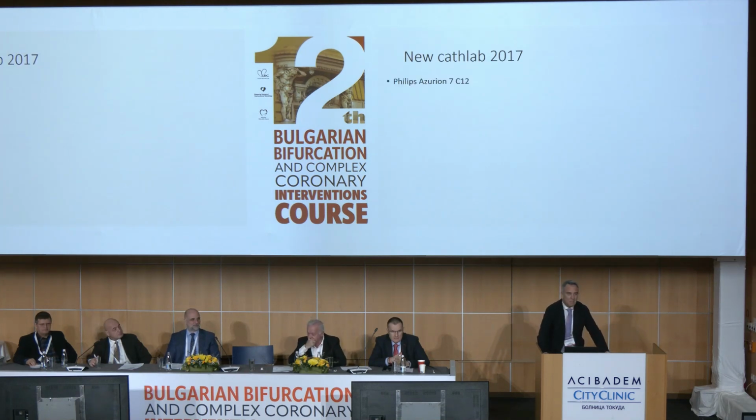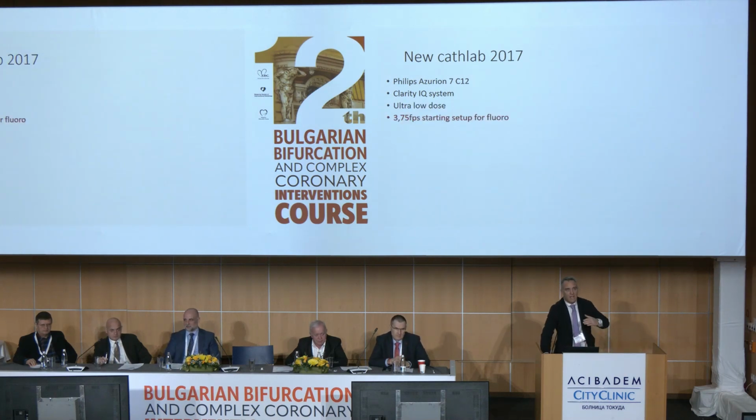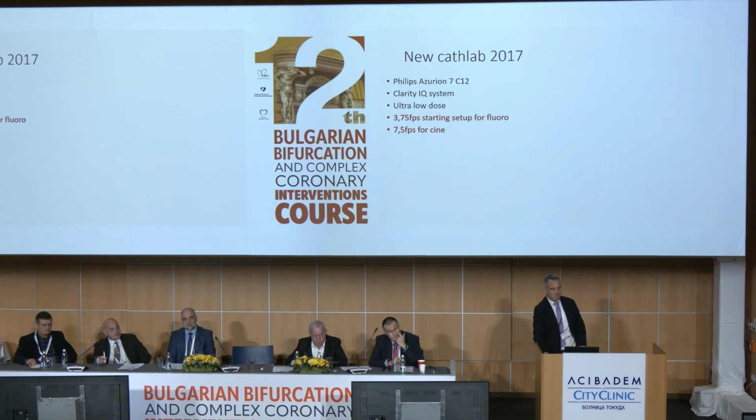We got a new cath lab in 2017. It was a Azurion 7 C12, with the Clarity system, ultra low dose. And we started the fluoro for every procedure at 3.75 frames per second. At first, the Philips worker said, no, it's not going to work. I said, come on, just put it, and we tried to do it ourselves. And 7.5 frames per second for cine.